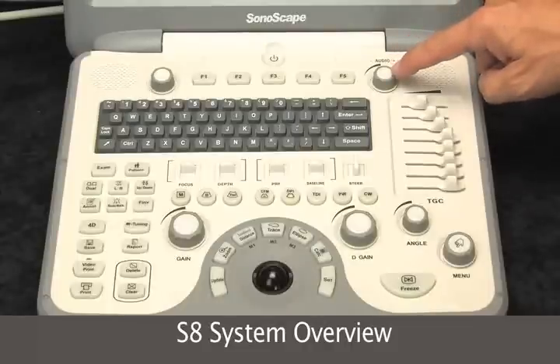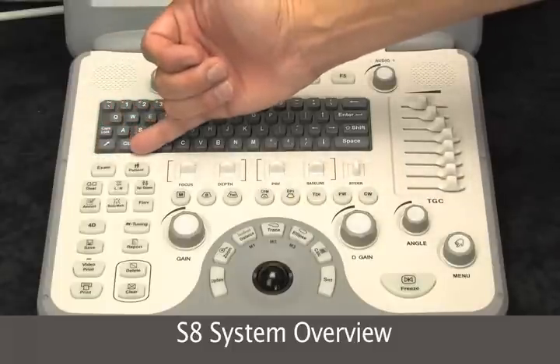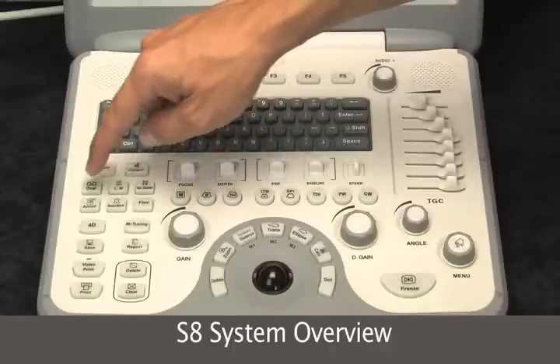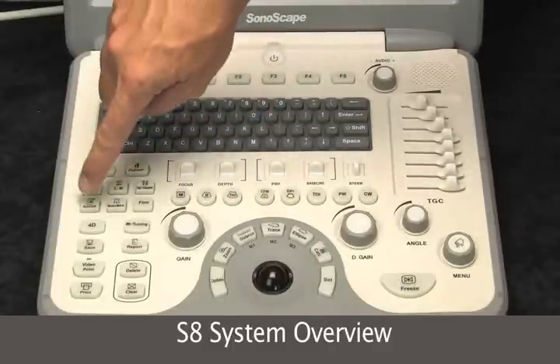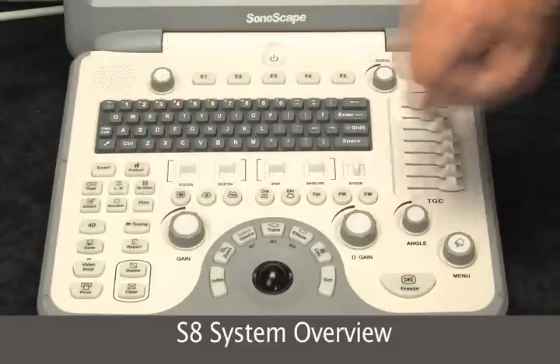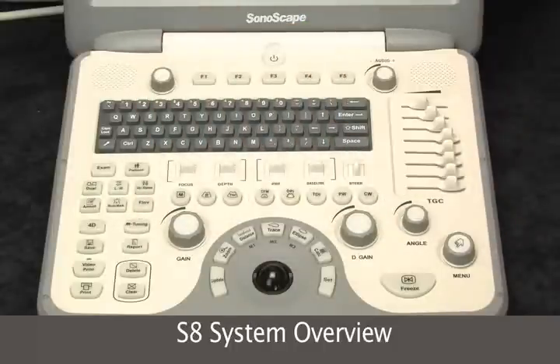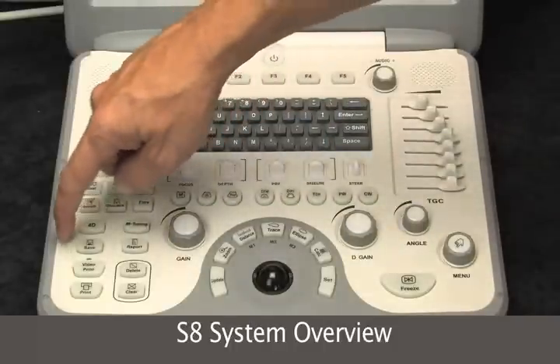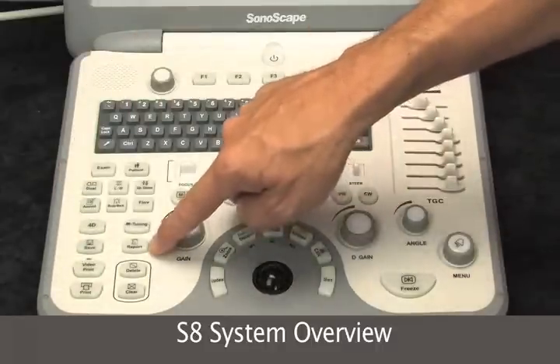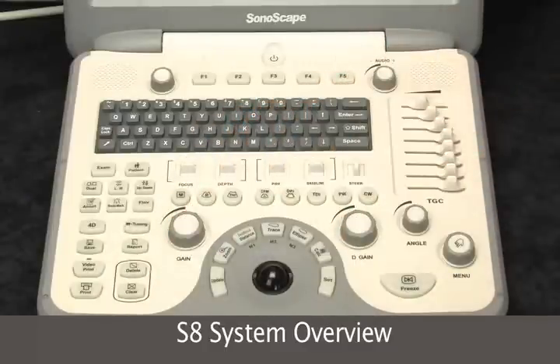This is your overall audio output of the instrument. To begin, we select our exam type, enter our patient name, and we have our image orientation — left, right, up and down, dual. This is our annotation and body markers, and flow invert, associated with your spectral and color flow Doppler. M-tuning is the one-button image optimization for the system. Save video, print — this is how we store our images. And our reporting. Deleting and clearing has a circle around it so you can be careful not to do that by accident.